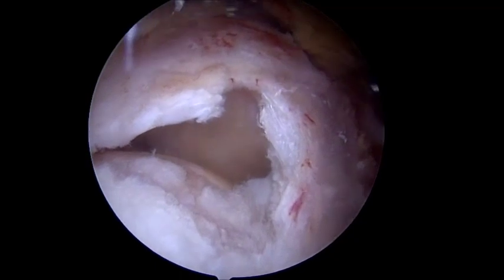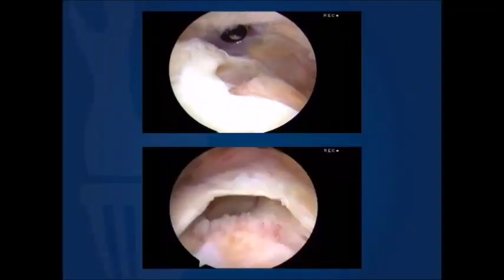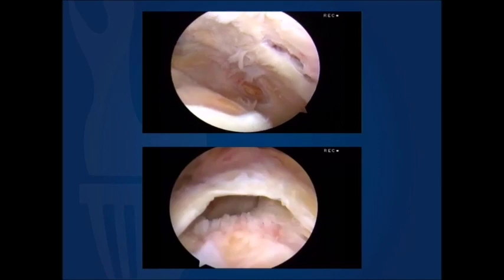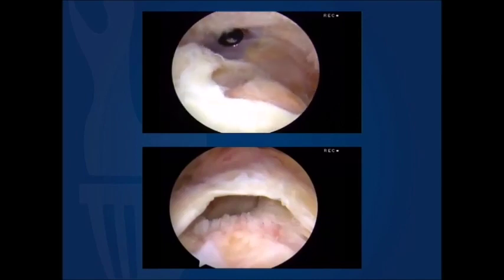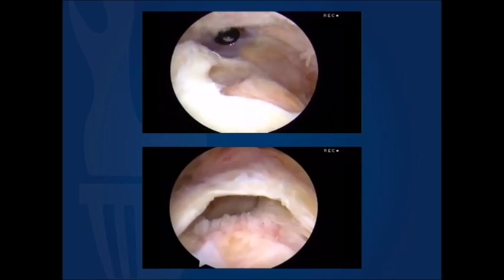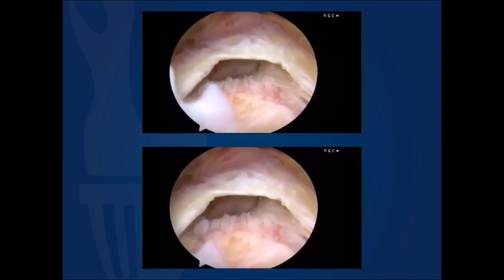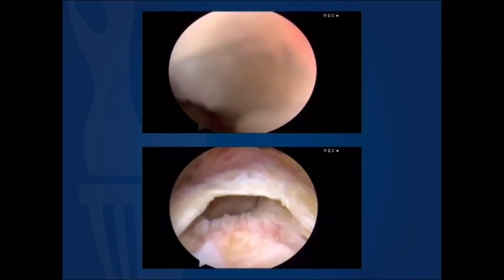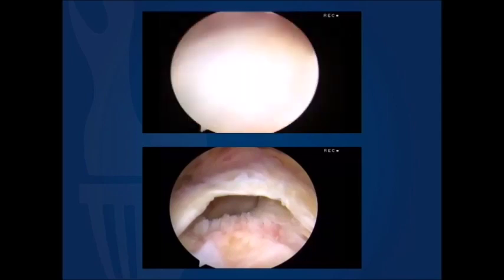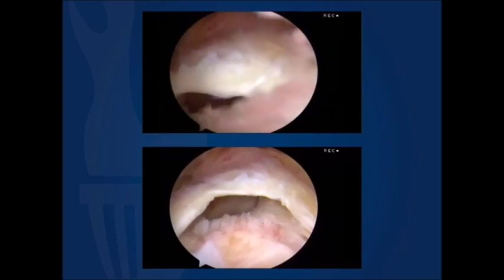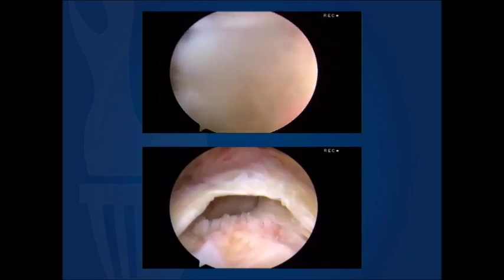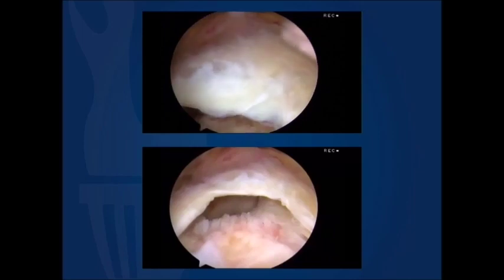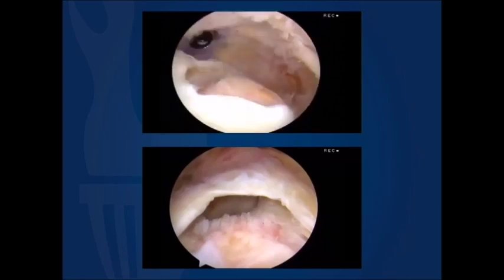In this separate example, a left shoulder in the beach chair position is viewed posteriorly. We can see that as we move to the lateral viewing perspective and back the camera up to improve and broaden our view, this fascia limits our ability to do so.